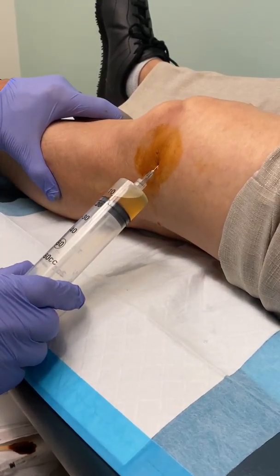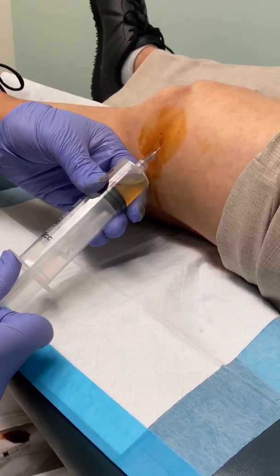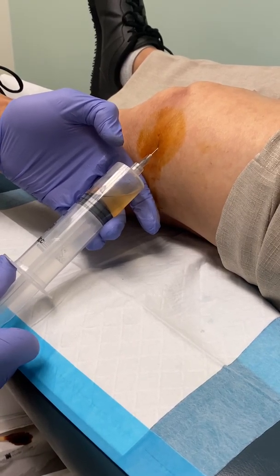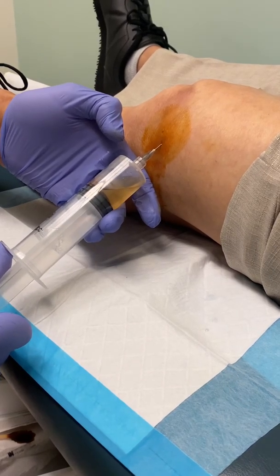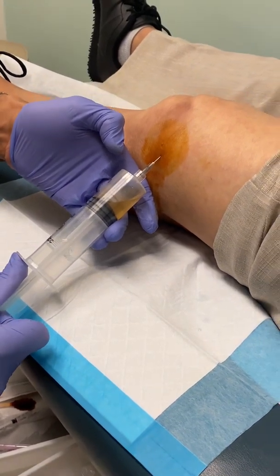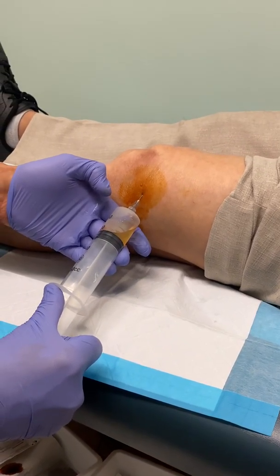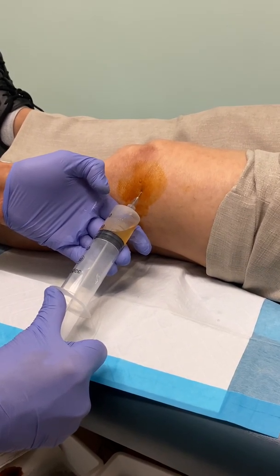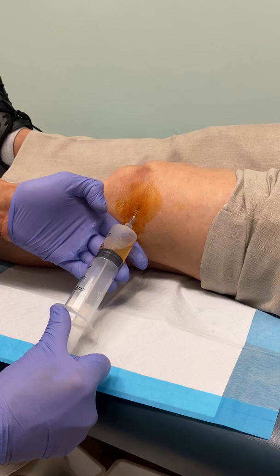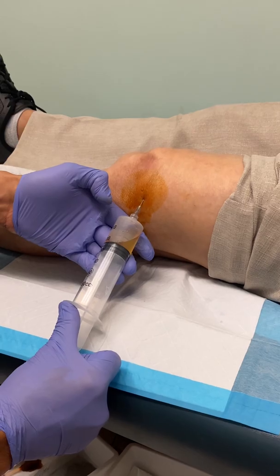I'm going to rotate her a little bit like this because I need to get in there and get some more fluid out. It looks like normal looking arthritic fluid. But once I remove this fluid, it'll eliminate some of her pain. Now if it stops flowing, I'll use my ultrasound and redirect the needle a little bit. But I just wanted to show you what a knee aspiration using a painless technique is like, especially in a patient that already had an attempt and they couldn't get the fluid out. All right, you guys take care. Thank you.